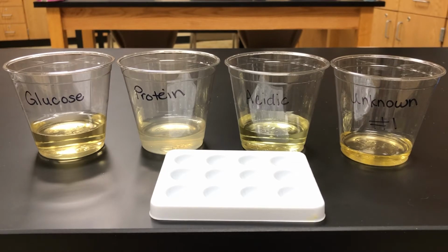Urinary tract infections, kidney malfunction, diabetes, and liver disease are just some of the medical problems that can be diagnosed through urinalysis. Okay, so the purpose is to test urine samples for traces of chemicals.